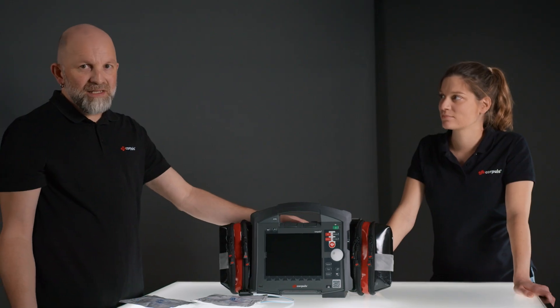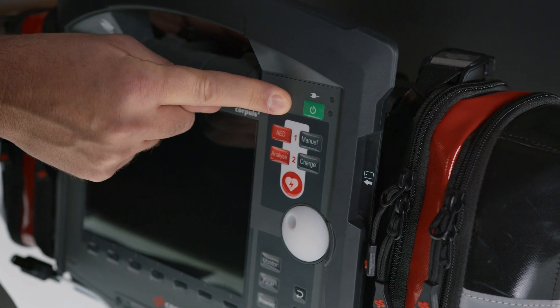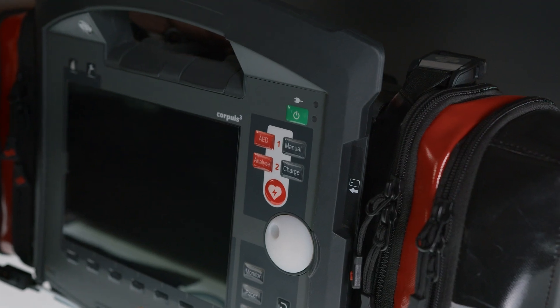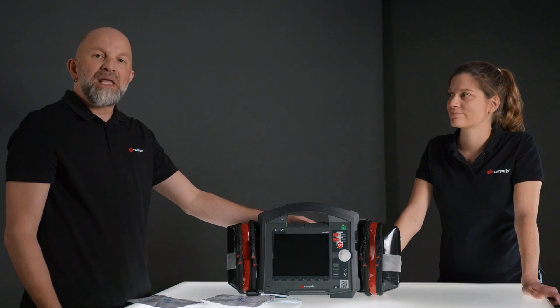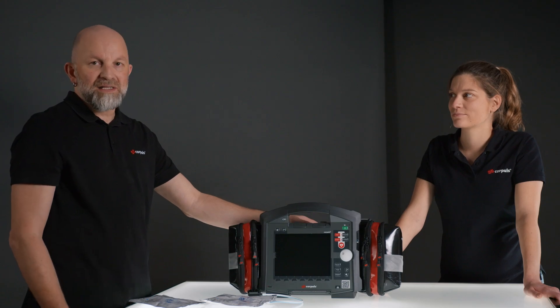To start the device we have two options. One is the regular on/off key, and the other is using the two keys — AED and manual. If we choose this option, the device will start directly in the corresponding mode and the device start-up process will be shortened.